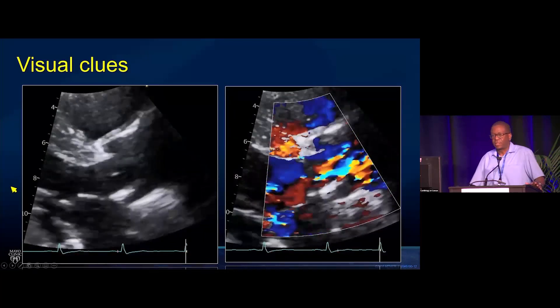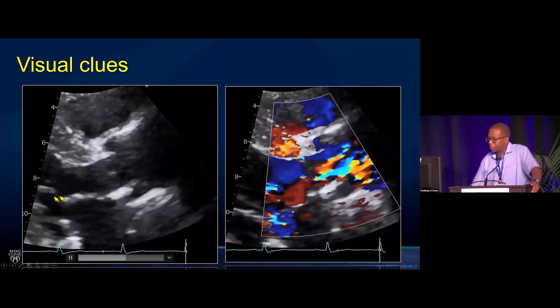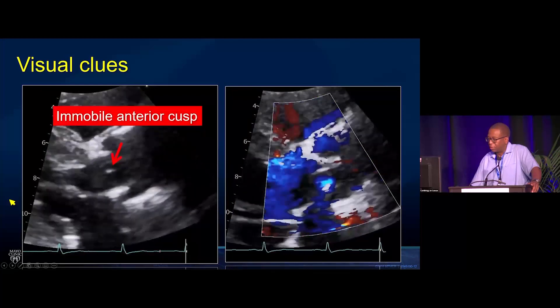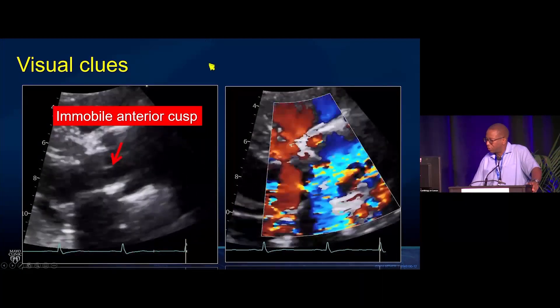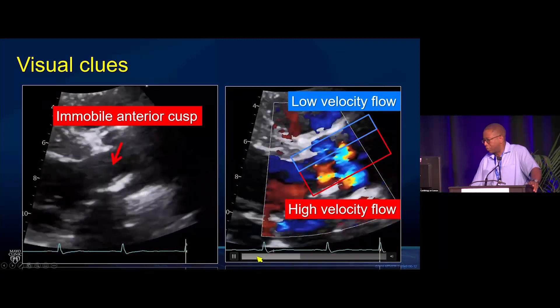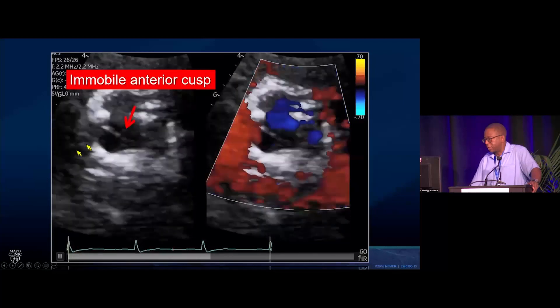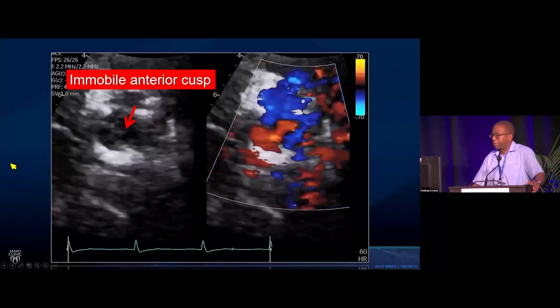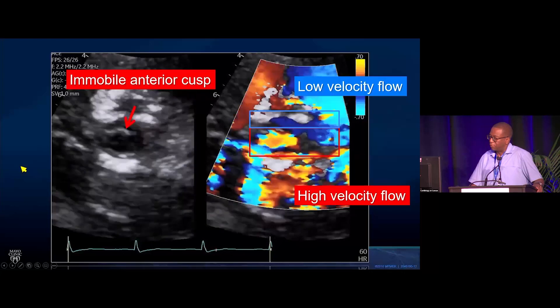Part of the evaluation of this prosthesis is that you should get clued in on some of the visual clues of bioprosthesis dysfunction, either thrombosis or degeneration. If you pay close attention, you can see that the anterior cusp of this tissue prosthesis is not moving as well as the posterior cusp. Flow across the valve shows the anterior part has low-velocity flow and the posterior part is where most of the flow is going through — high-velocity flow. You can see the same thing in the short axis: reduced mobility of the anterior cusp and differential flow across the aortic valve prosthesis.